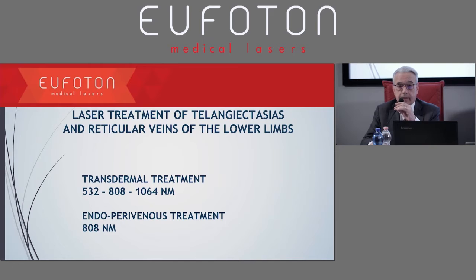So these small telangiectasias, these small veins, reticular spider veins, had to react because they had these chromophores. But we didn't take into account the structure of lower limbs.